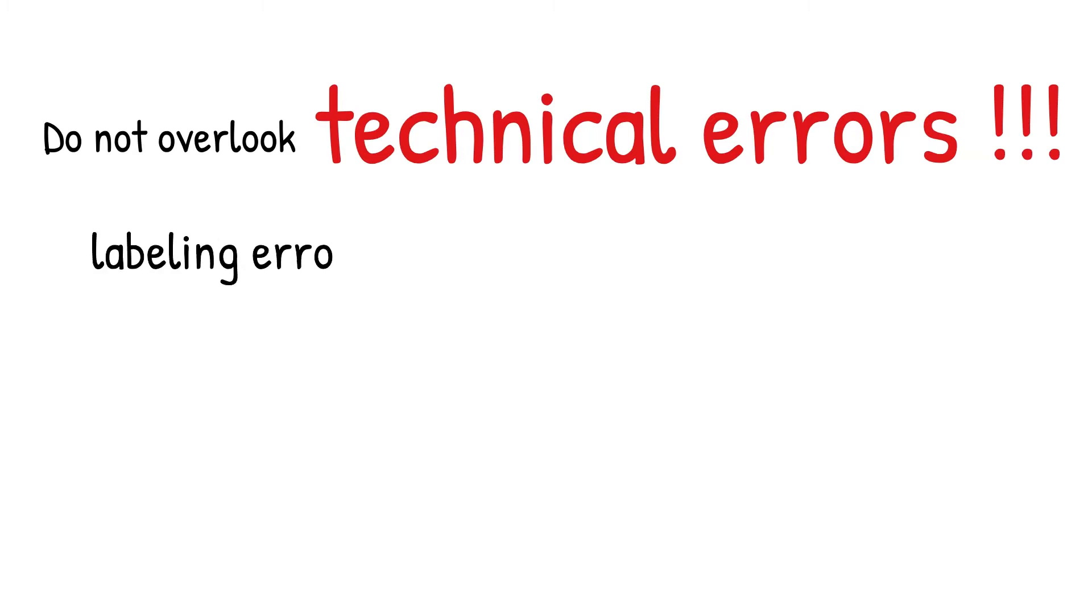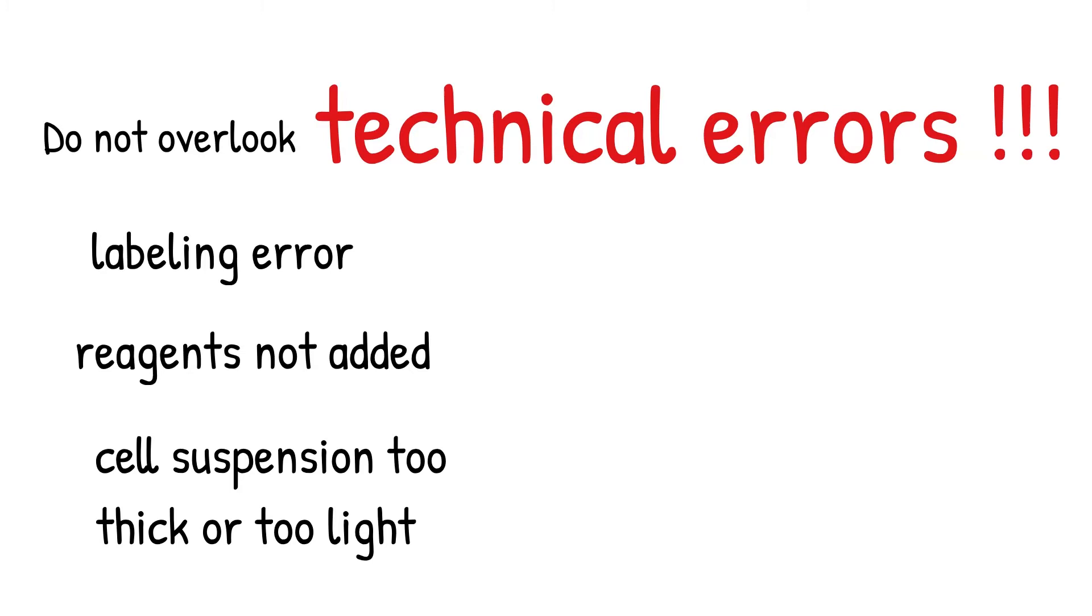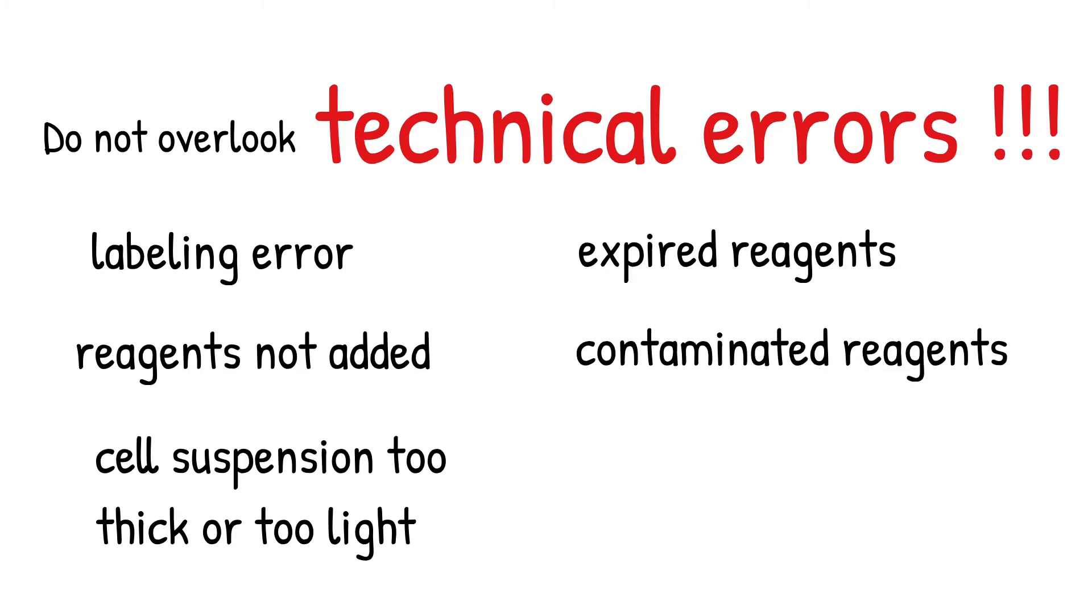Technical error include things like labeling error, forget to add reagents or wrong reagents added to the test tube, cell suspension is either too thick or too light, expired reagents, contaminated reagents, or equipment failure such as uncalibrated centrifuge.